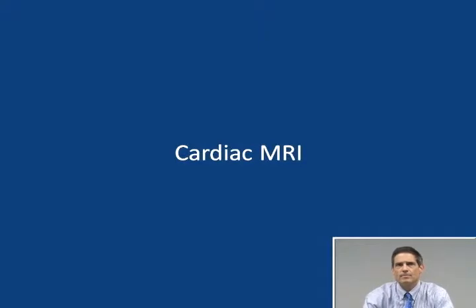Cardiac MR, well, despite years of intensive development and a lot of investigation, MR seems to be one of these things that's going to be development in the future rather than present. Right now it's used in research purposes and with ongoing developments it may find more use. It's usually used for people that can't have IV contrast in larger centers. The technique continues to evolve. It is possible that cardiac MR may one day provide a single modality that can look at the coronary arteries, cardiac valves, and myocardium in one exam. Right now, it's not really something that's going to be routinely ordered by primary care providers.